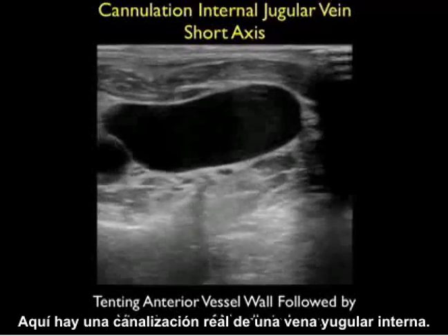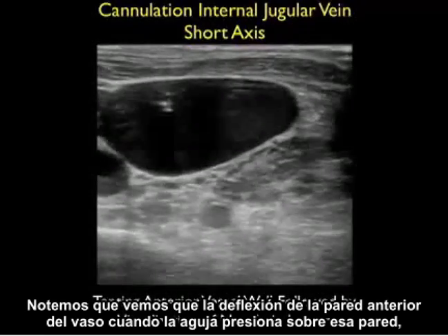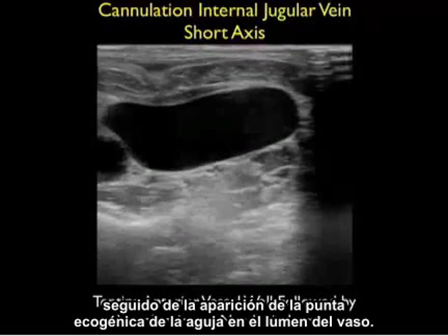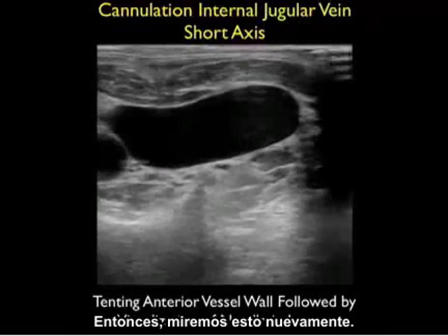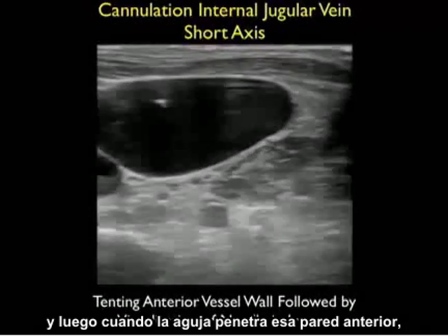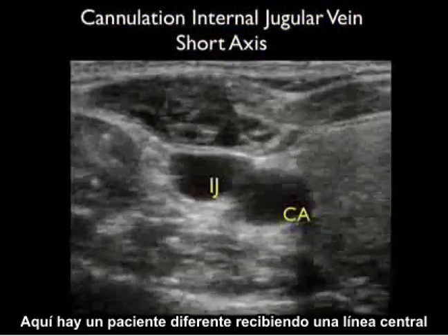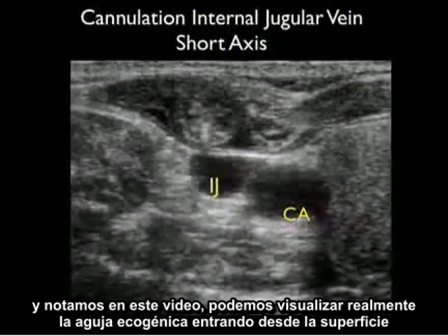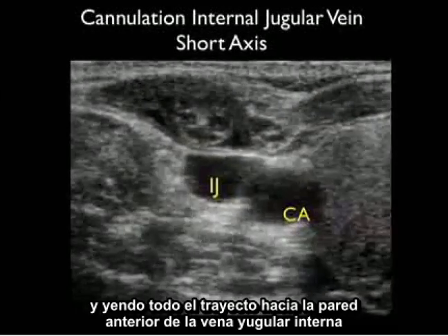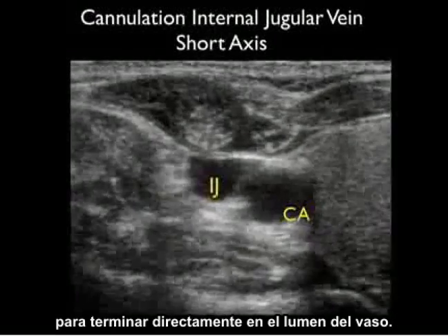Here's an actual cannulation of an internal jugular vein. Notice the deflection of the anterior wall of the vessel as the needle pushes down on that wall, followed by the appearance of the echogenic tip of the needle within the lumen of the vessel. Notice the deflection or pushing down of that anterior wall, and then as the needle permeates that wall, we see the echogenic tip appear within the vessel. In a different patient receiving a central line, we can visualize the echogenic needle coming from the surface and going all the way through the anterior wall of the internal jugular vein to park directly into the lumen.